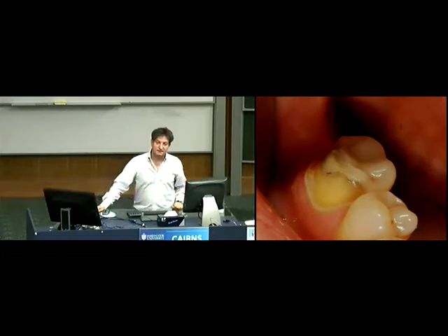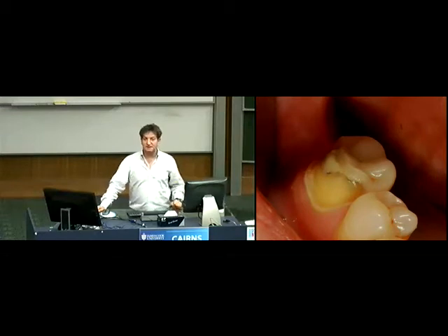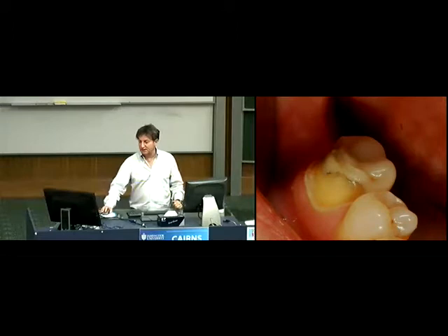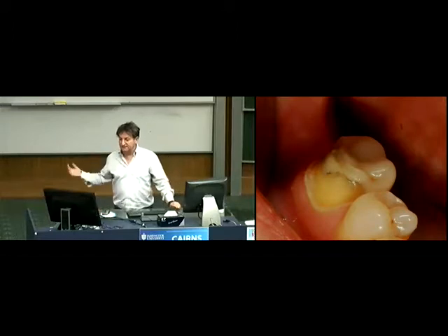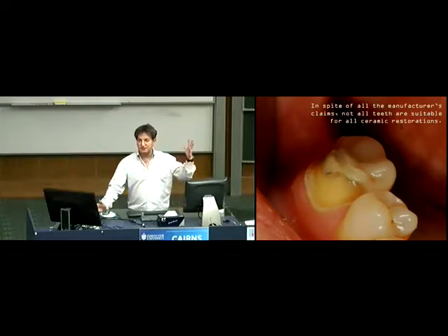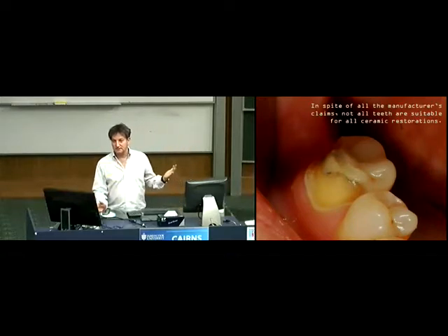What I'm suggesting to you is either client will try and convince you that this material is strong enough for everywhere, but it's not. It's really not. Not all teeth are suitable for all ceramic restorations. Again, don't get carried away in this revolution that we've got to go all ceramic. I mean, is zirconia really a ceramic?